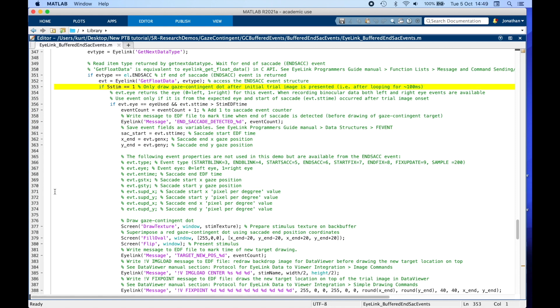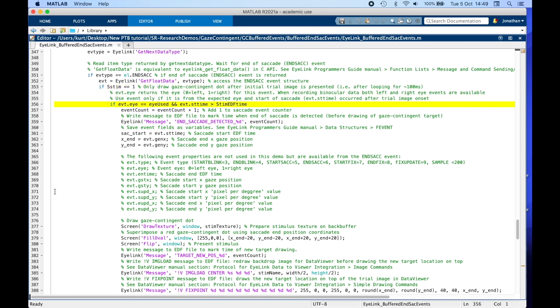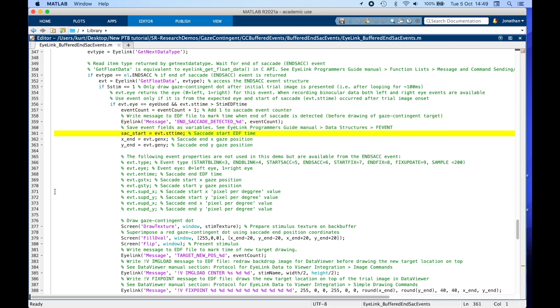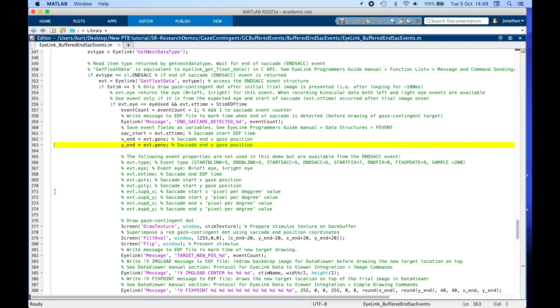Once the first stimulus has been drawn, so if at least 100 milliseconds have elapsed since we started the while loop, we can check whether we have data from the expected eye and at the start of the saccade, evt.sttime, occurred after trial image onset, so we don't use saccades which started before the time period we are interested in. Here, we are retrieving some saccade information, such as the start time as well as the end x and y position of the saccade.